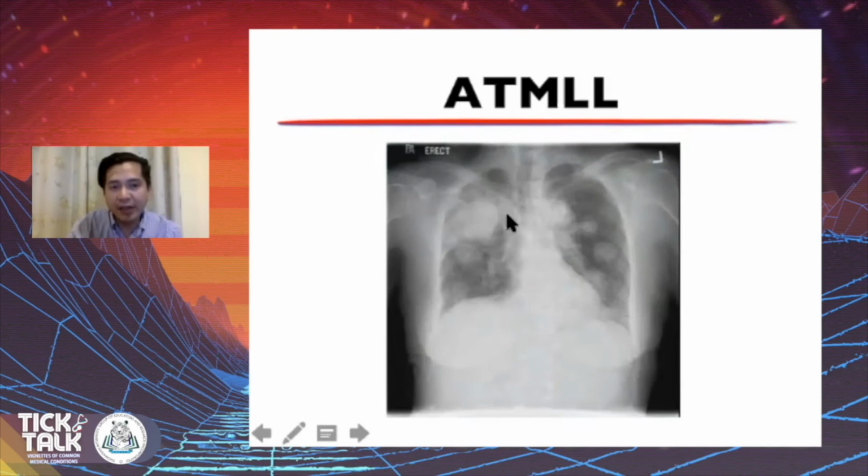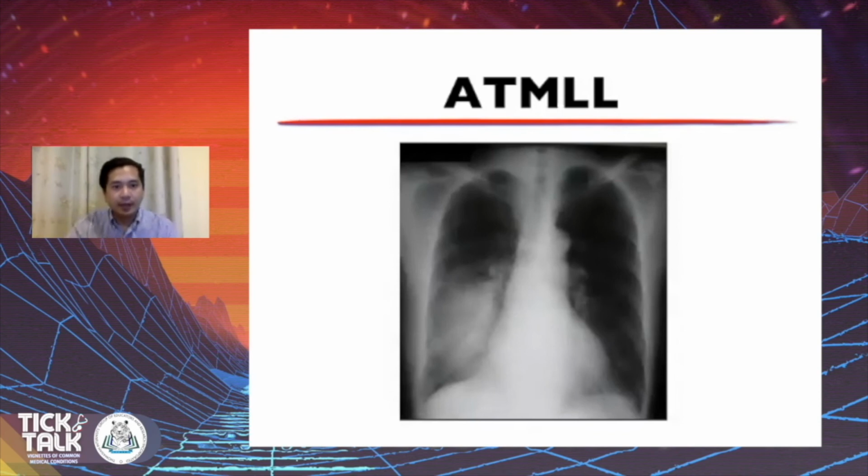This is also very common in other malignancies, ovarian, liver, causing cannonball lesions. For more lung lesions, we see here infiltrates on the right with air bronchograms. Clean on the left. This is consolidation pneumonia.